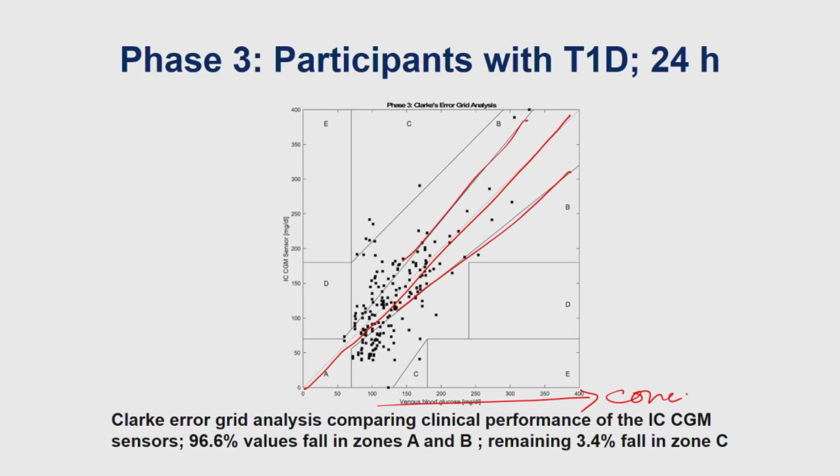And as you go towards a low concentration, the margin of error is much higher in the high concentrations, but in lower concentrations you have to be very careful. And that's again bringing us to the same problem of hypoglycemia versus hyperglycemia. Hypoglycemia can put somebody into a coma. Hyperglycemia, I'm not saying it's not bad, you need to control your glucose levels, but that happens over a certain period of time. But when that hits you, that also hits you very bad.